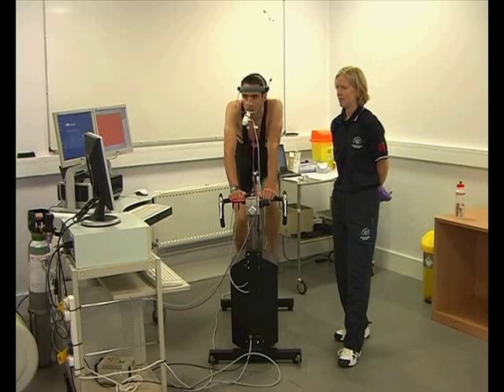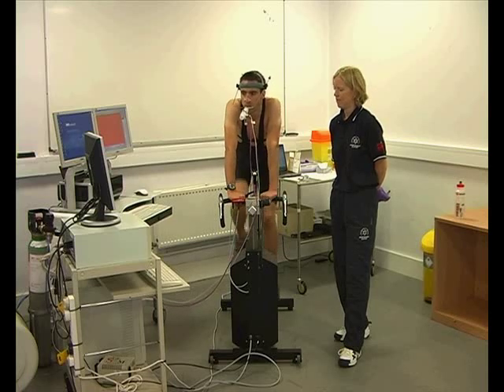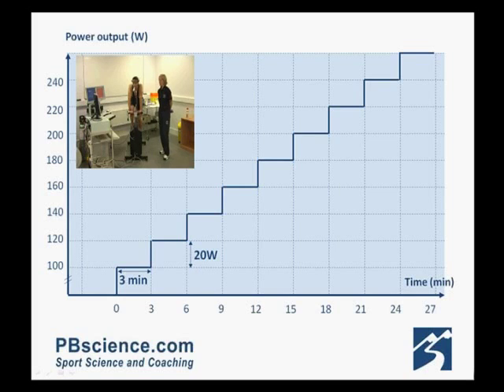We've got a bit of time now before the first blood sample has to be taken, so let's take you through the protocol for today's test. The athlete is pedalling at 100 watts. He's going to stay at this power for 3 minutes in total. Once those 3 minutes comes to an end, we take the blood sample. Then, the power output goes up by 20 watts for the next 3-minute stage to begin. And as you can see from this graph, we keep repeating that pattern every 3 minutes.